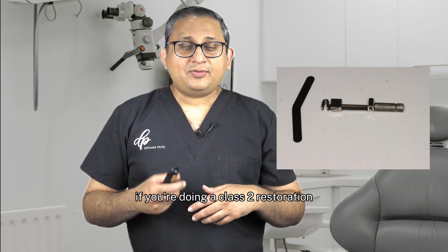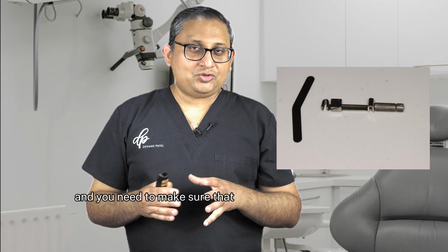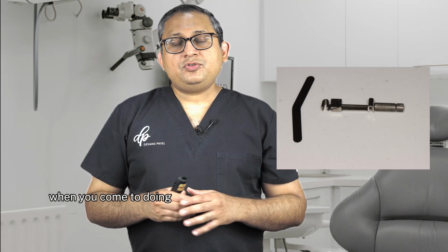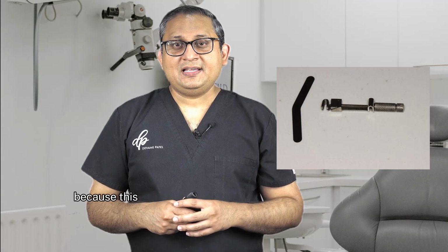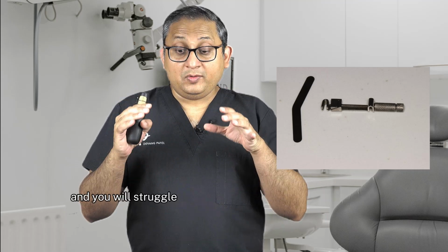However, if you're doing a class 2 restoration, then you need to really understand this philosophy, and you need to make sure that you understand this before you do a class 2 restoration. When you come to using the Tofflemire matrix band, you can't just simply use it like this and put it in the patient's mouth, because this is not going to go past the maximum bulbosity and you will struggle.